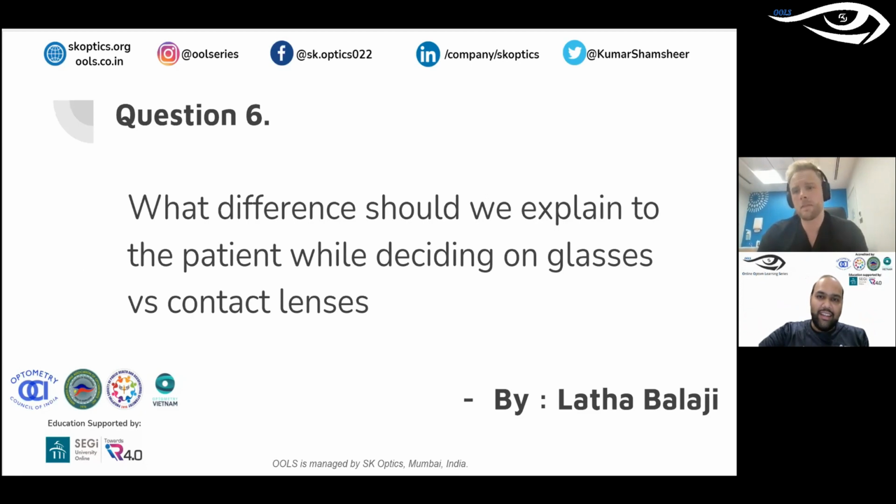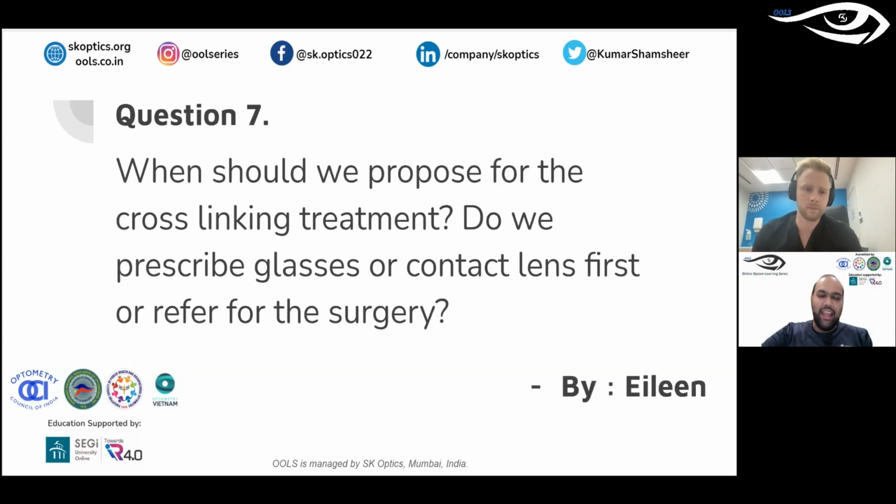Just planting the seeds. A lot of these patients you're going to see every 6 months or a year. So they'll go away and think, oh, do you know what? Quite often it's the nighttime driving that's really started bothering me, and that's the one that I always think, well, you know what? I think contact lenses might be a great option for that. But just plant the seeds early. Contact lenses are fantastic. You can take these patients from counting fingers to 6/5 in 2.5 seconds when you insert a lens. It's really a modern day marvel, contact lenses. Yeah, right. That's well said.